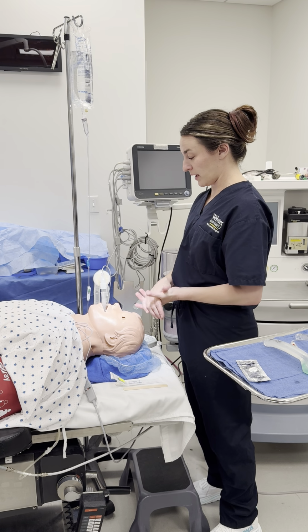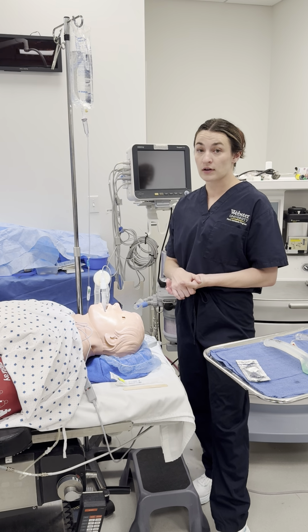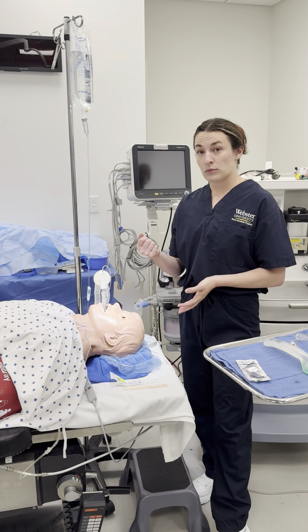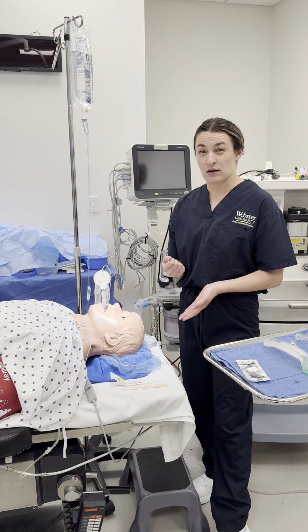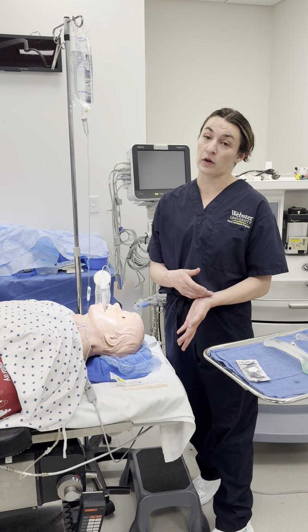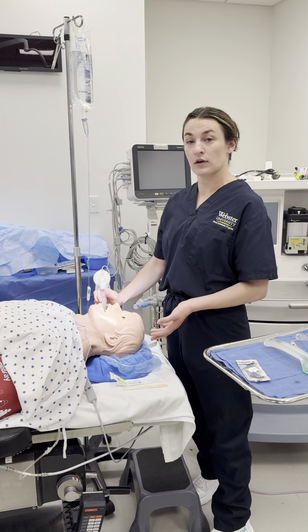But now that you've got your LMA in place, you're going to want to make sure when you go to remove this LMA that the patient is still under enough general anesthetic that you can safely remove it without them biting down so that you're unable to get it out. Or you're going to want to wake the patient fully up so that they follow commands and can open their mouths enough so that you can remove the LMA.